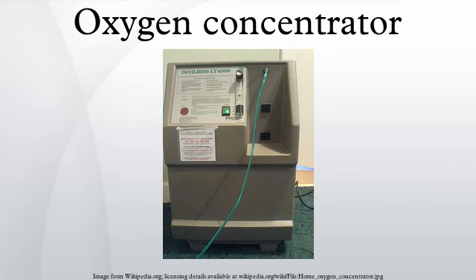As the first cylinder reaches near pure oxygen in the first half cycle, a valve opens and the oxygen-enriched gas flows to the pressure equalizing reservoir, which connects to the patient's oxygen hose. At the end of the first half of the cycle, there is another valve position change so that the air from the compressor is directed to the second cylinder. Pressure in the first cylinder drops as the enriched oxygen moves into the reservoir, allowing the nitrogen to be desorbed back into gas. Partway through the second half of the cycle, there is another valve position change to vent the gas in the first cylinder back into the ambient atmosphere, keeping the concentration of oxygen in the pressure equalizing reservoir from falling below about 90%.